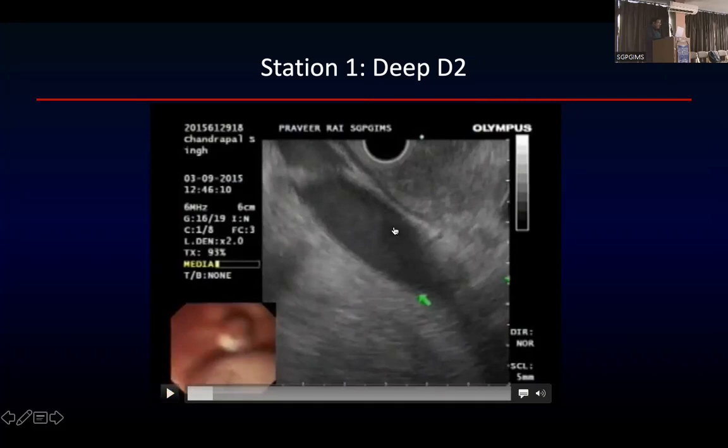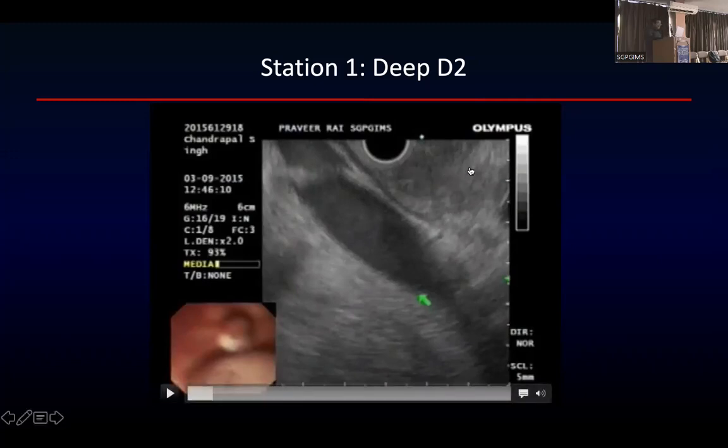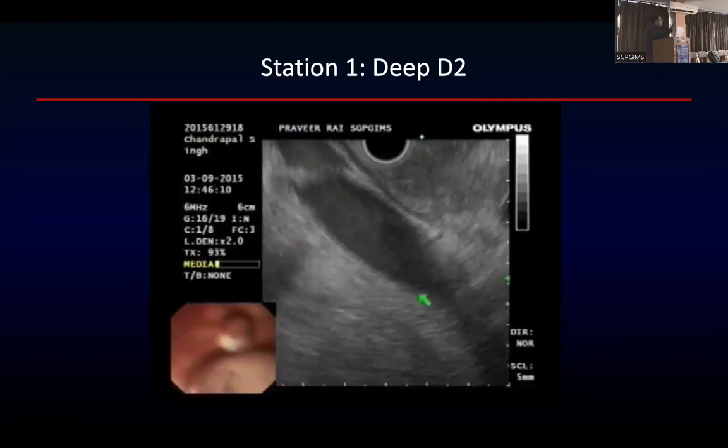If you see this aorta, when you see the linear anechoic structure aorta, you are pulling back. The part of the pancreas that comes into the picture is an uncinate part of the pancreas. That's it. इतनी ही आपको anatomy देखनी है beyond D2 से. This is very, very important to sample lymph FNA from the uncinate process. And what I can tell you is this is the most difficult part of the examination of EUS beyond papilla.